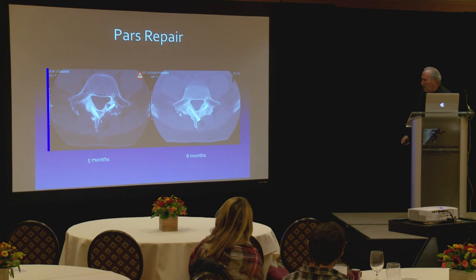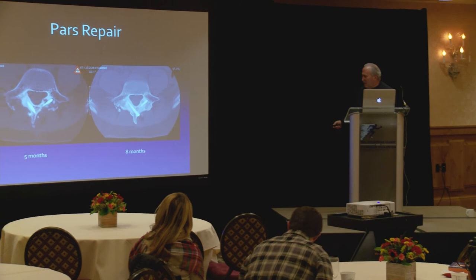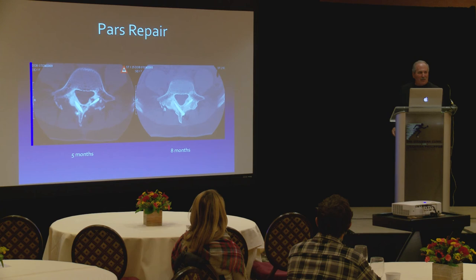Yes? Just to clarify, your intent when you move based on these kids is you're going to the back... Well, here you can see, this was 5 months down the road, and I was seeing this side healing. This side was questionable, but here's 8 months down the road, and you can see the whole thing's healed in. I use a special sauce, so to speak, to fix these that I'm not allowed to talk about, but it works very nicely to get these to heal.